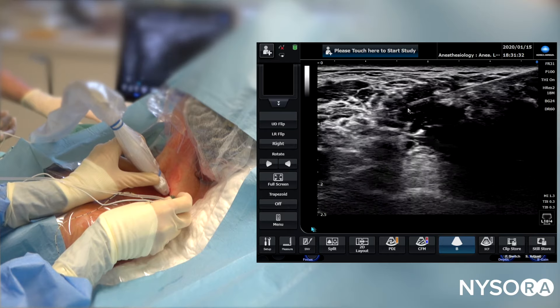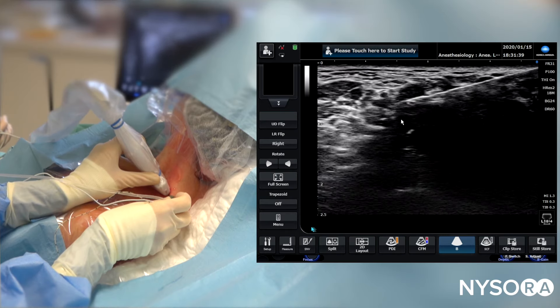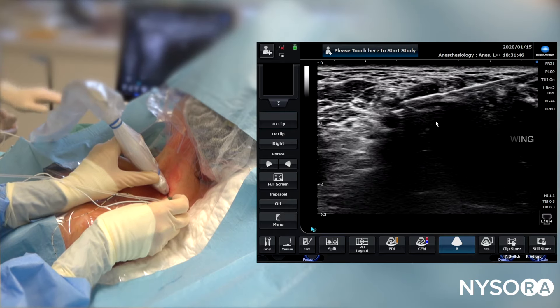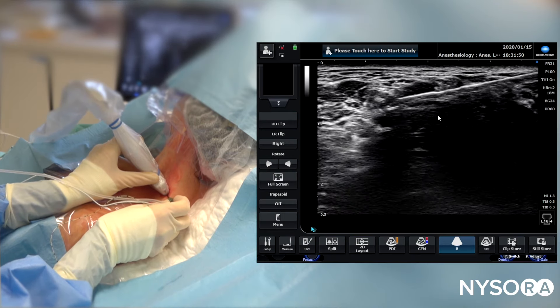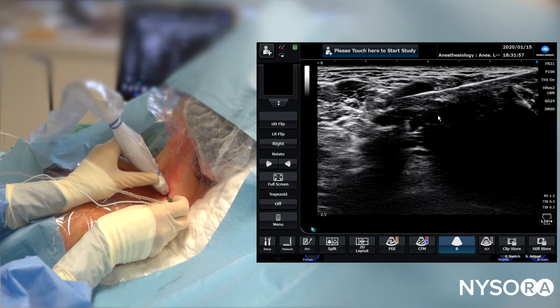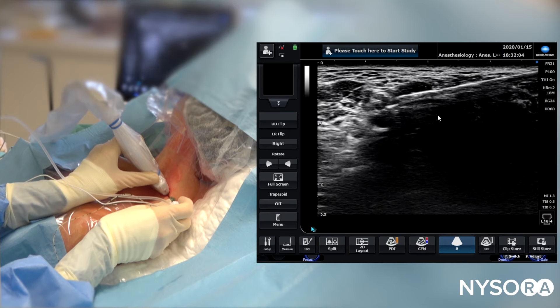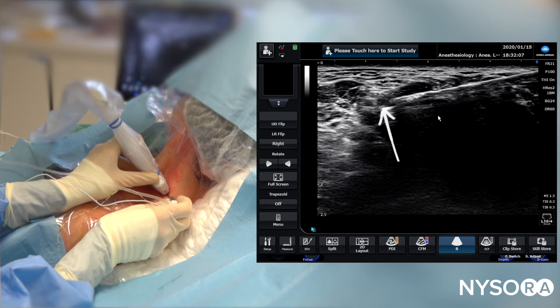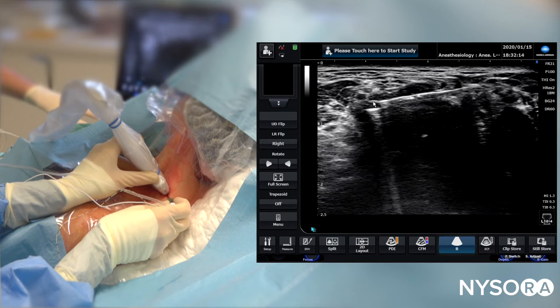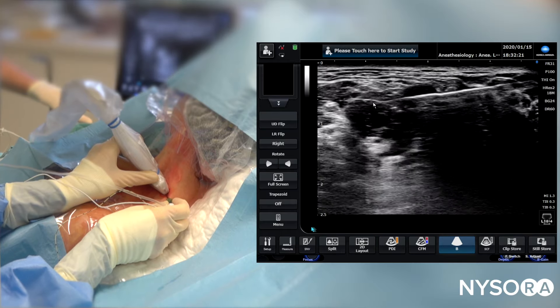We're going to try to insert the needle tip between C5 and C6 while avoiding a motor response. Visualization of the needle creates a shadow, which is normal. The nerve stimulator is set at 0.5 milliamps and we have no motor response. Aspiration is negative, and an injection should — and does — result in displacement of the brachial plexus. This injection and displacement allows us an opportunity to approach the plexus a little closer with the needle.